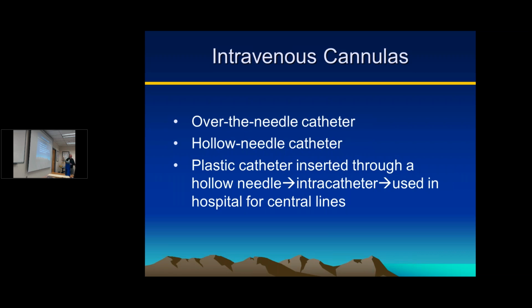What's the other thing you're looking for outside just the size itself? So it goes from 14 to 24 gauge. 14 obviously being bigger, 24 being smaller. Why does the length matter? That's what we hear. Right answer, for the wrong reason, but right answer. Or something else.